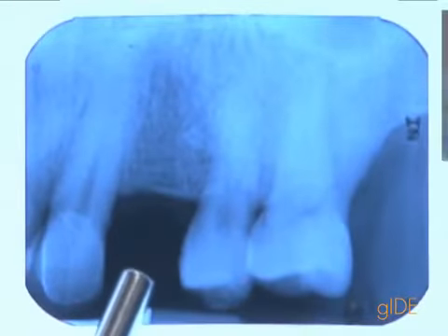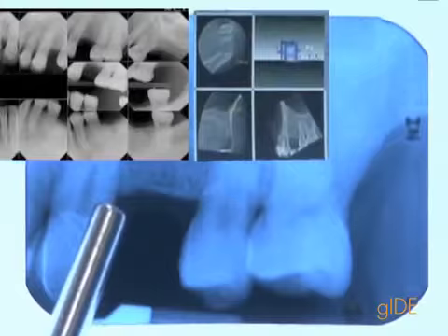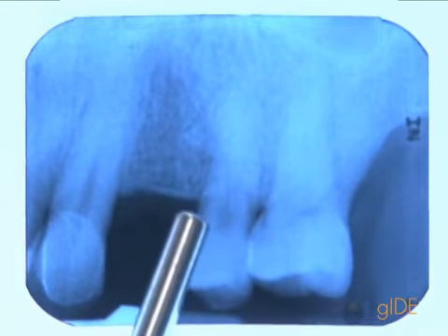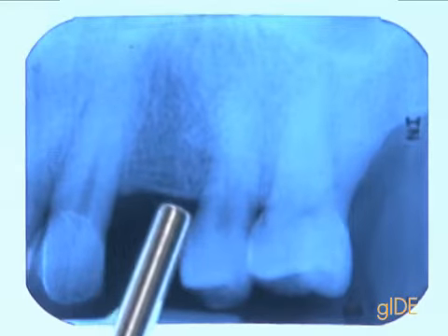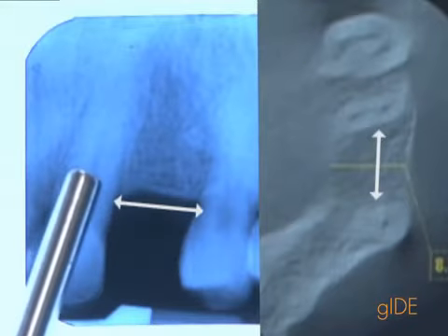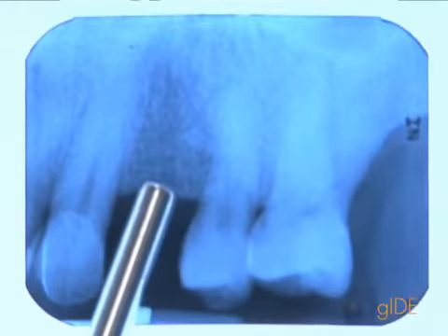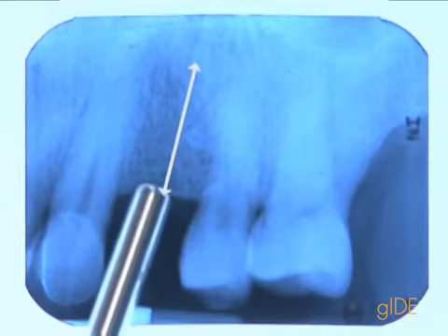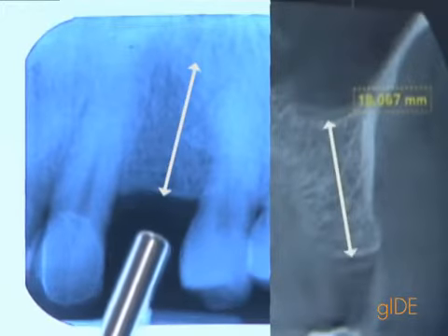Based on the information we have, we can now decide that a diameter of an implant of 4.3, so regular platform, is the appropriate diameter, as we have 8+ millimeters in this mesiodistal space. The length of the implant will be 13 millimeters, based on that we have more than 15 millimeters of height. Based on the CT scan, it's 18.